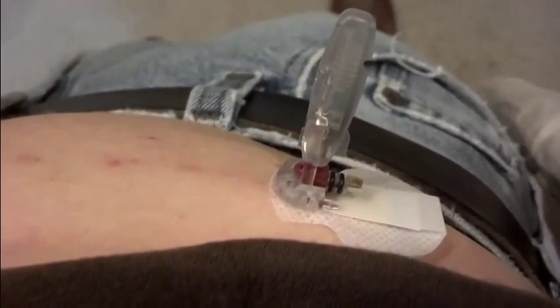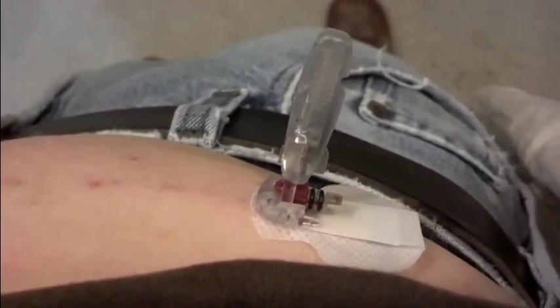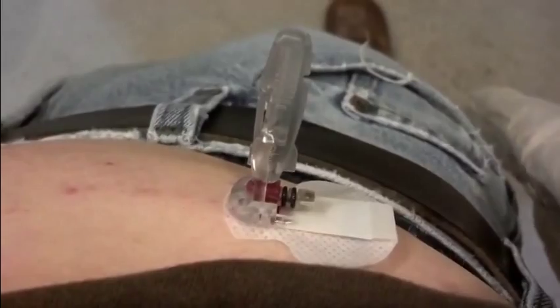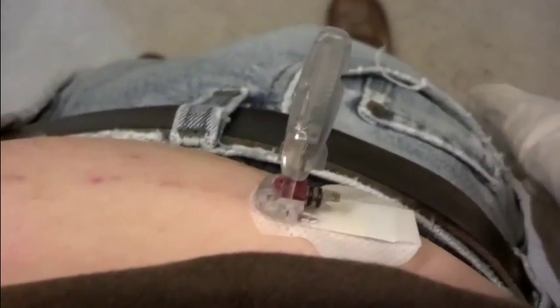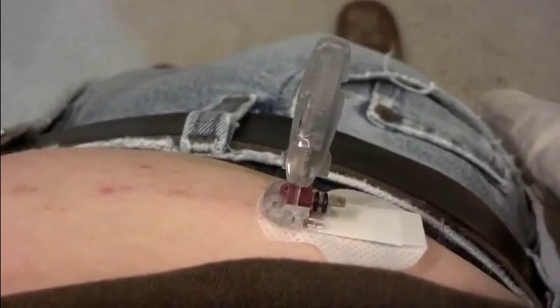I'm trying to pull this thing out and it's not coming out. My next step is going to be to just rip the thing out with the needle in place. That's not going to feel very good, I'm sure.